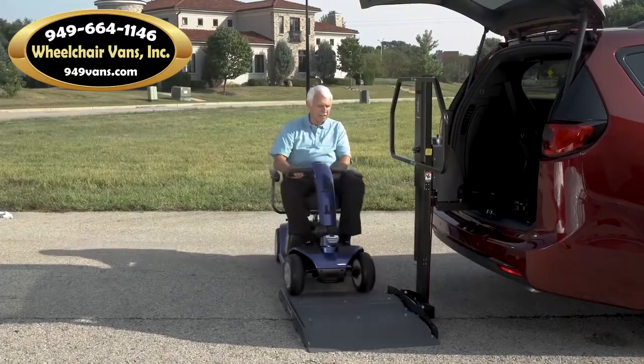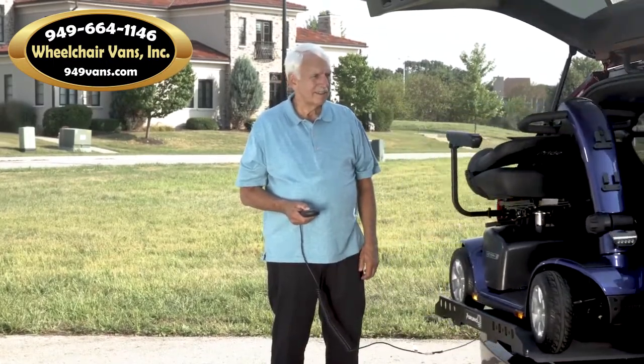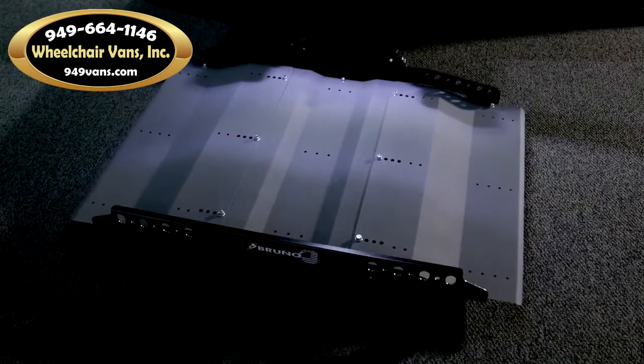Just drive up, push a button and your mobility device is neatly stowed inside your vehicle and away from the weather elements. A backlit hand control and illuminated platform makes it easy to load and unload at night.